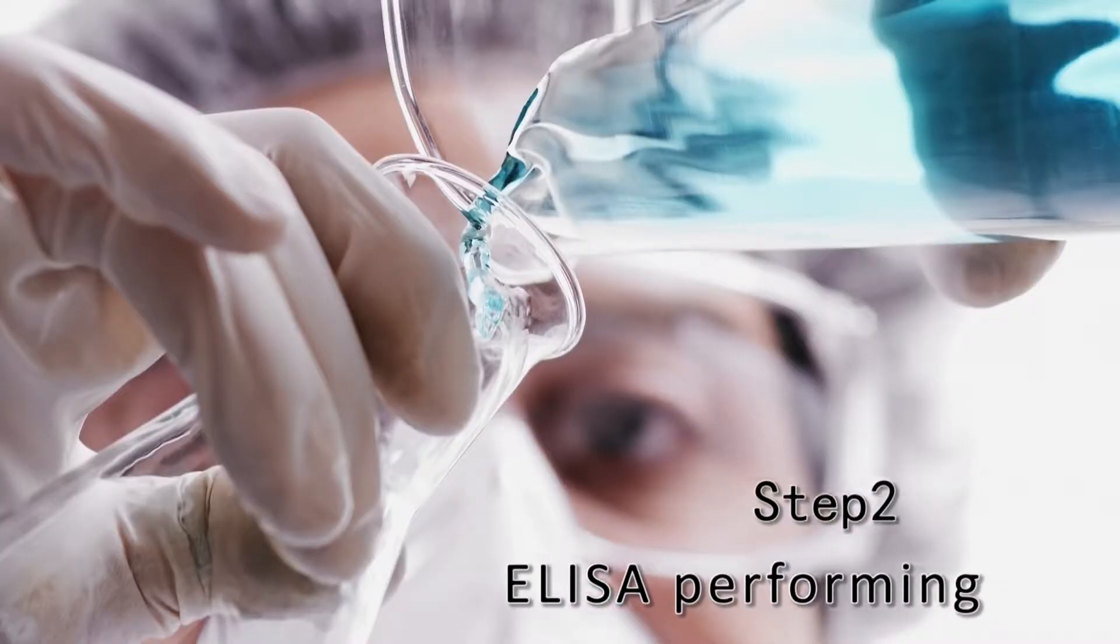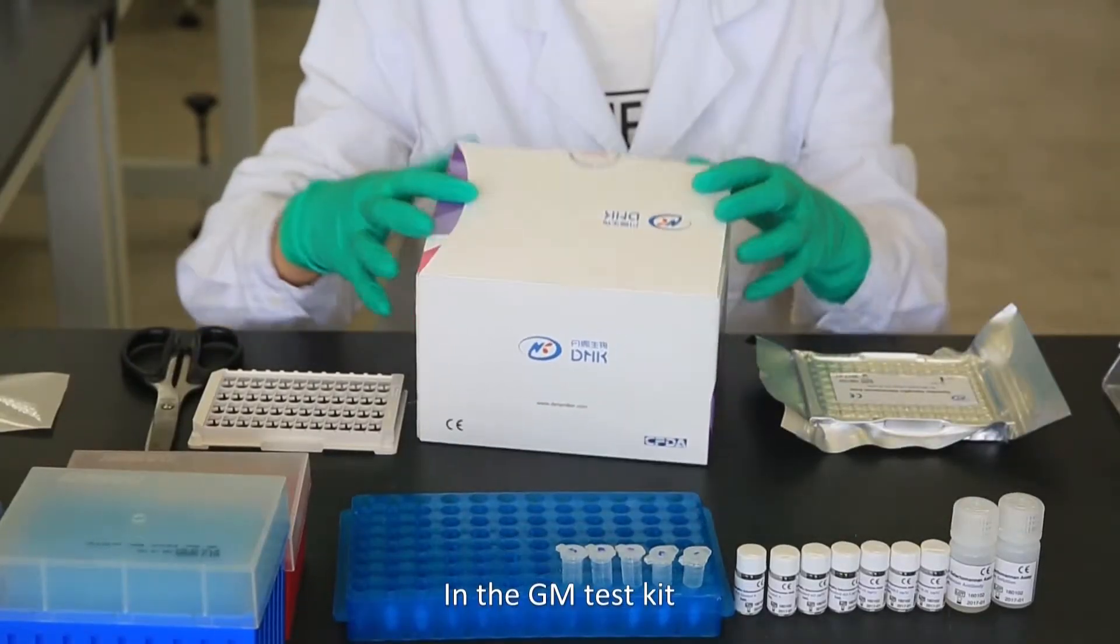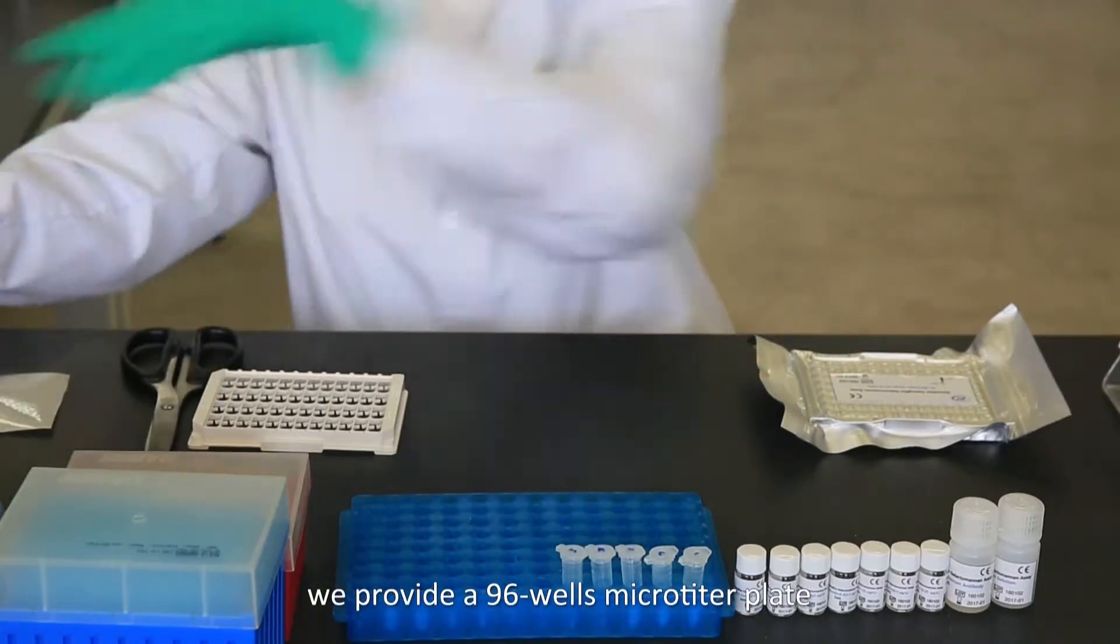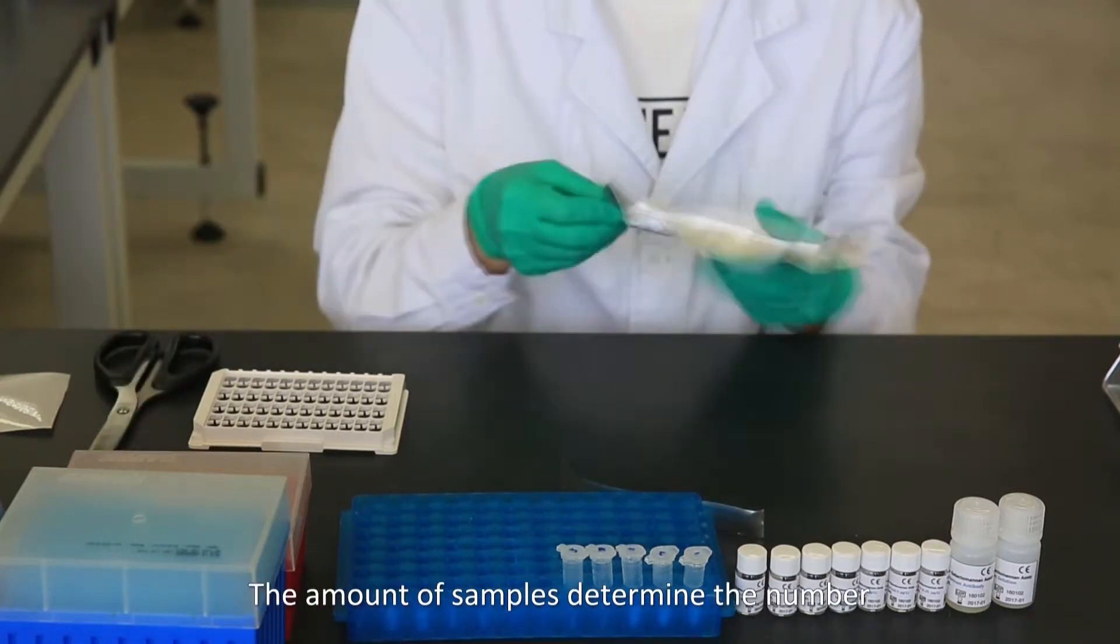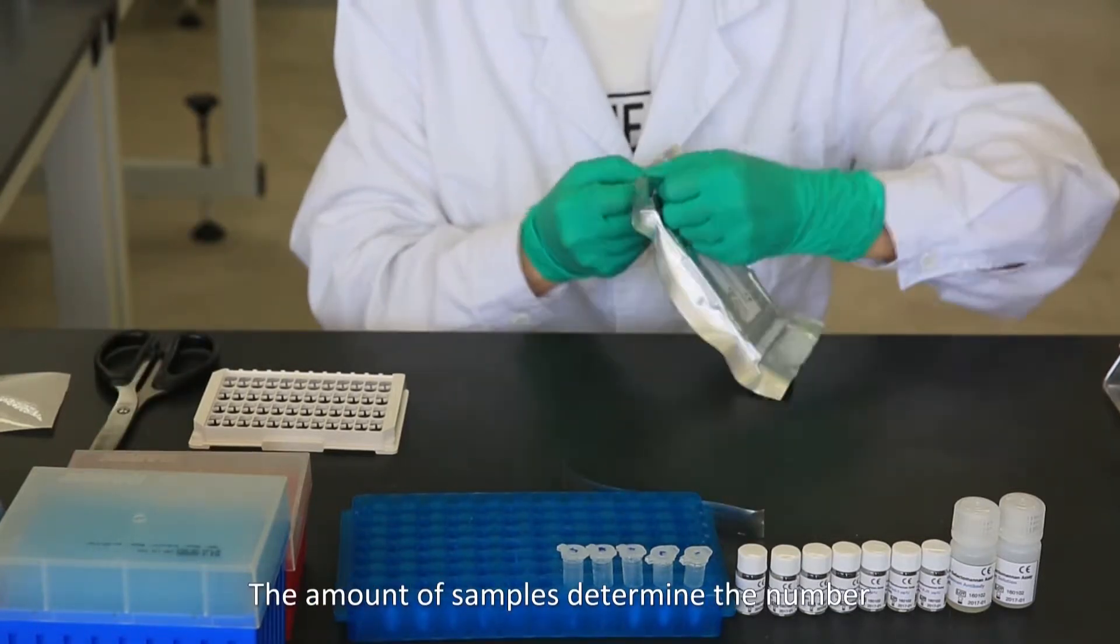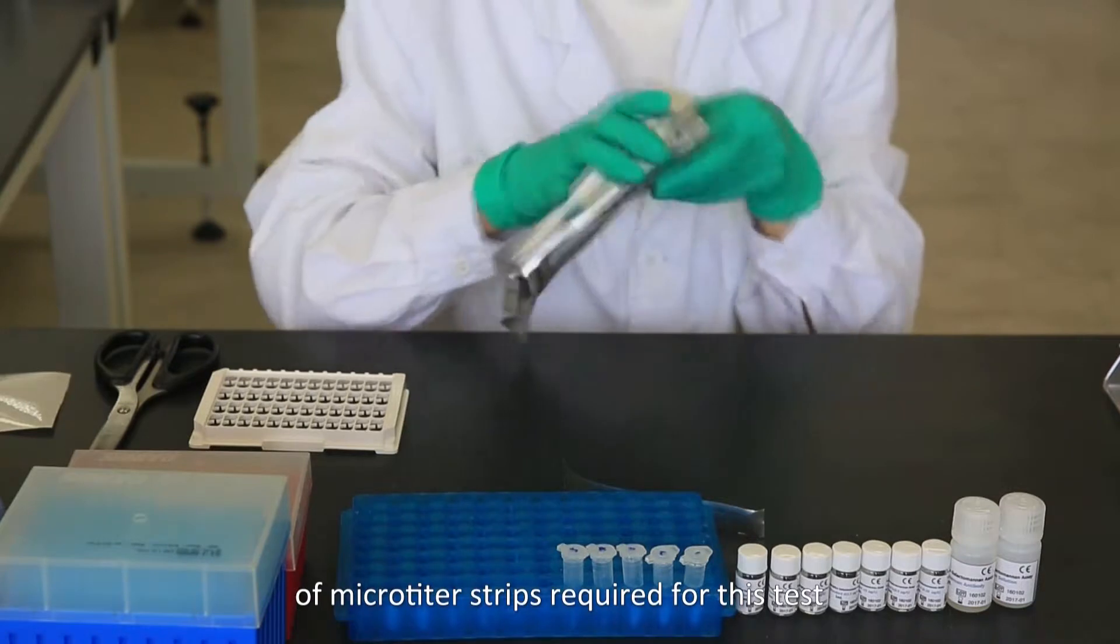ELISA performing: In the GM test kit, we provide a 96-well microtiter plate coated with anti-galactomannan. The amount of samples determine the number of microtiter strips required for this test.